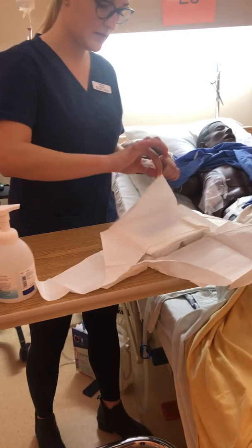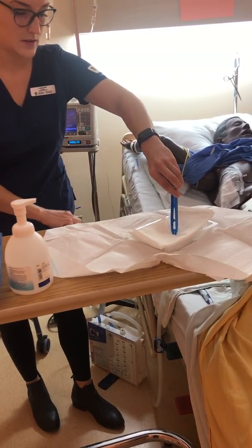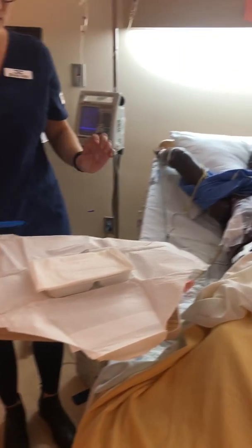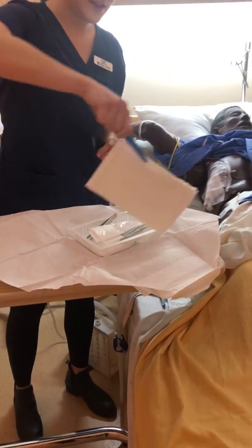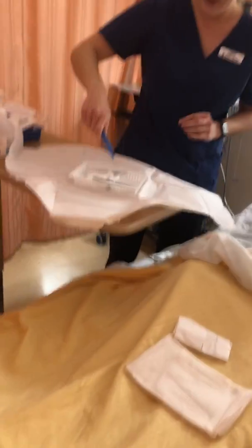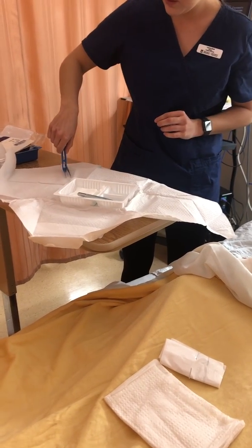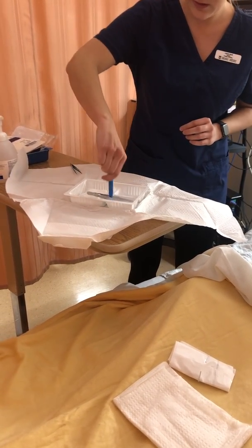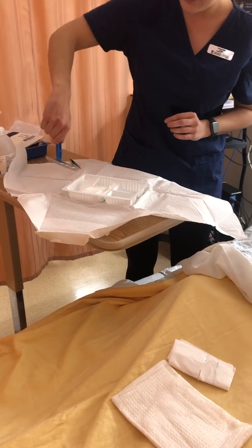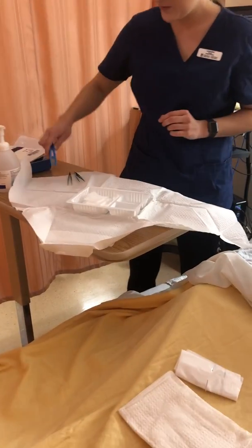Okay, I'm going to grab my forceps. Okay, and then I know that my 1-inch border is here, so I'm going to remain aware of that. I'm just going to take this out because I know I don't need that. I also don't need this garbage bag here. I'll get my other forceps out. Ready. Okay, oops. Make sure those don't touch my hand. Okay. Good, so those are ready.